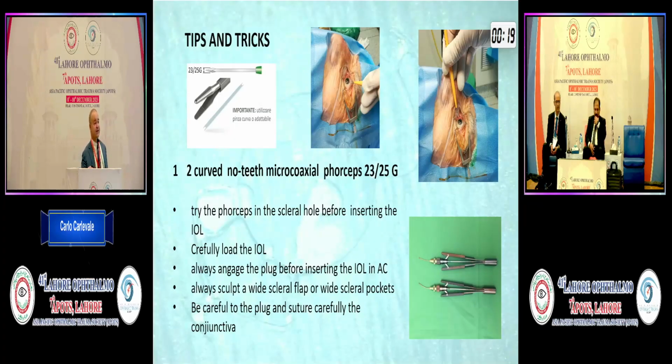As with every procedure, we need to know exactly the tips and tricks. It is mandatory to have 2 microcoaxial forceps curved, not straight, because if we have a deep-set eye, big nose, or a prominent frontal bone, you will never be able to engage the plug. So it is mandatory to have curved forceps.